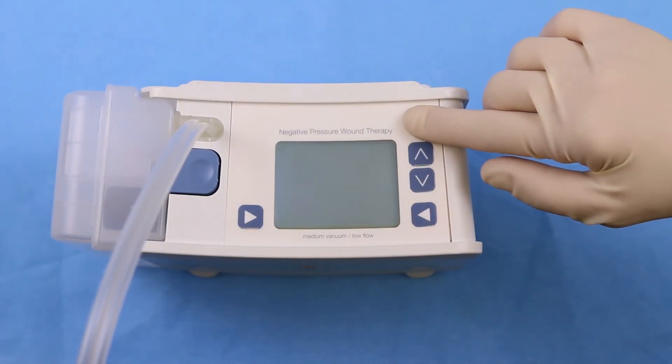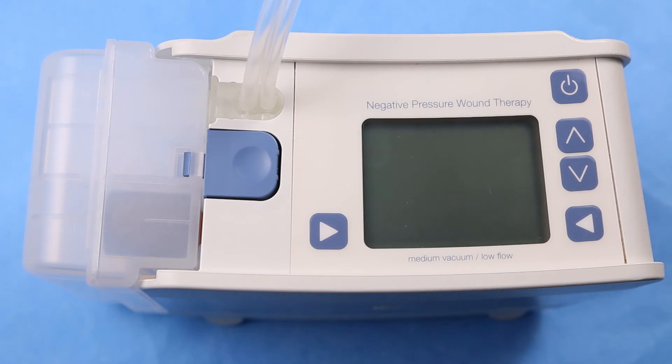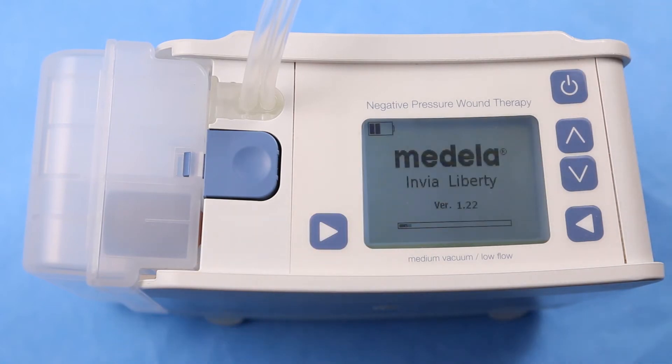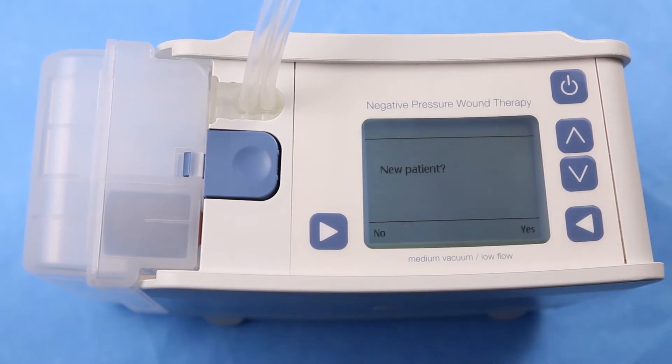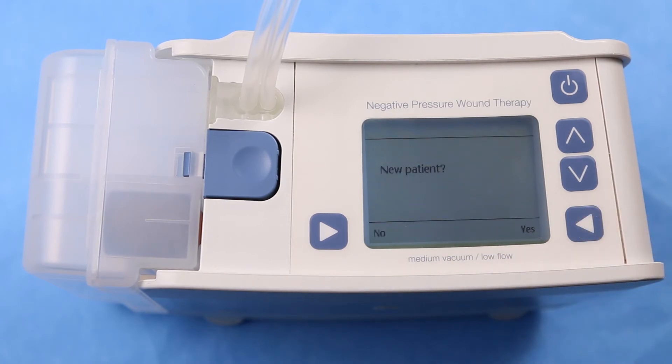Switch the Envia Liberty Pump on by pressing the top right button. To initiate therapy on a new patient, the pump must be turned on in administrative mode. To enter administrative mode, press and hold the bottom left button, then press the top right button. Acknowledge the disclaimer by pressing the bottom right button next to OK to confirm. 'New patient? Yes' means the pump will issue a new therapy ID number, which can be noted in the patient's chart. 'No' means the previous therapy ID number and settings remain unchanged. Press the button for the appropriate response.